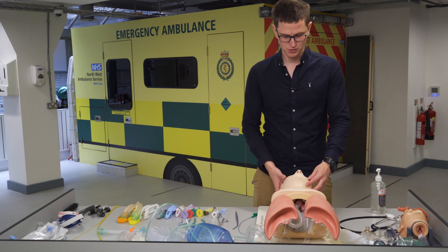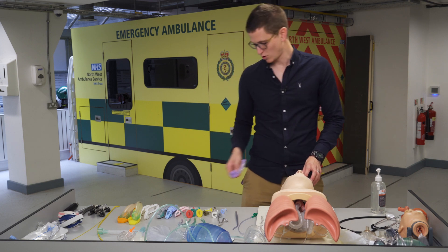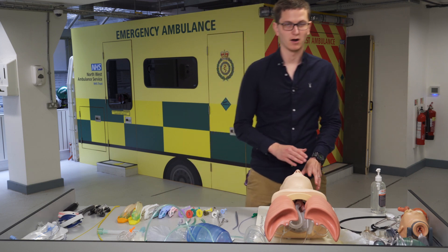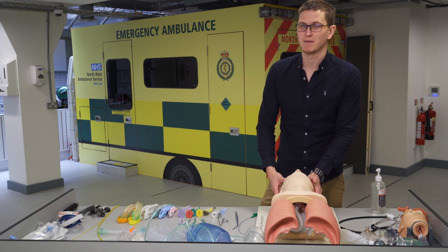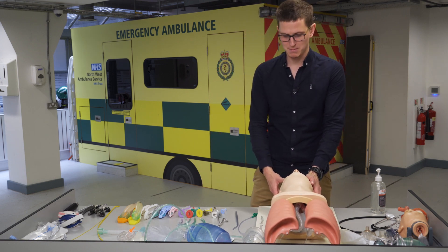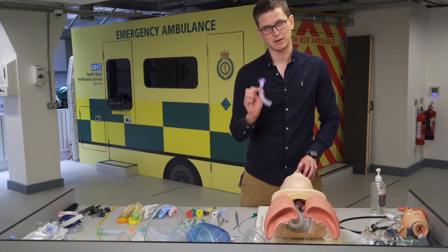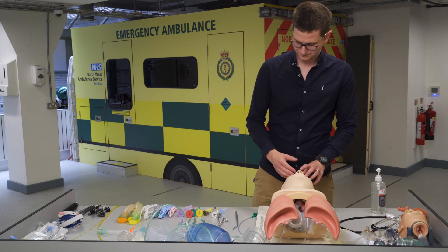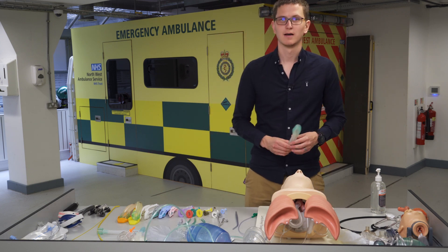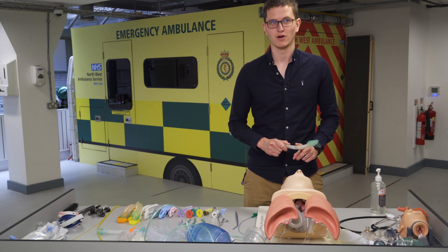An open airway is when you do a head tilt or put in an OPA. A maintained airway means the airway is being held open by a device, such as an OPA or oropharyngeal airway. If an iGel is in, we have an open and maintained airway, but not a protected airway.